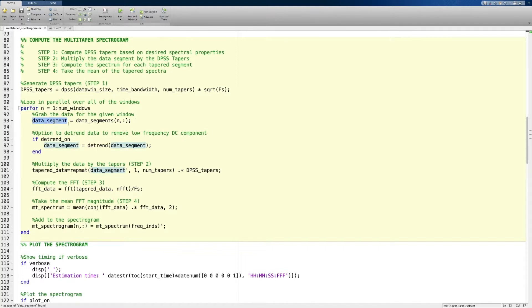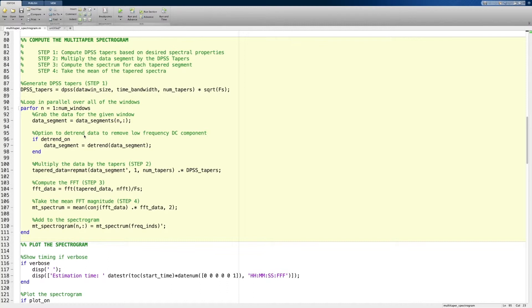After grabbing the data segment, we do something interesting. One of the issues with EEG data is what's called DC drift. Over the course of many minutes, you can see a slow drift in the EEG baseline data. This is due to changes in impedance as a result of changes in galvanic skin response and other features of the recording system. One way to handle this is to do a linear detrend to remove it, because without doing so it would produce a very large low-frequency signal. You can also do a specific band pass filter if you so desire.